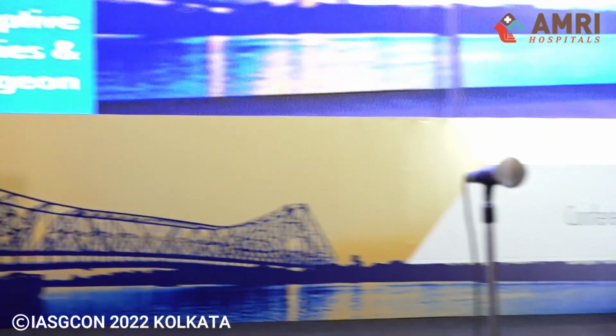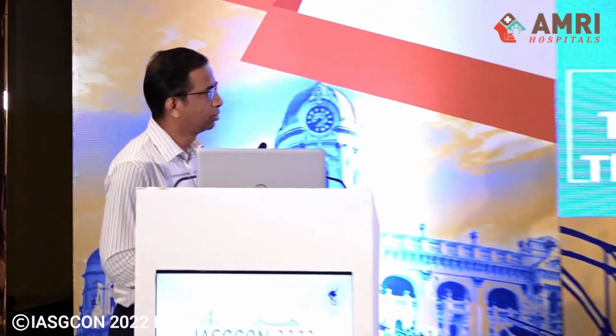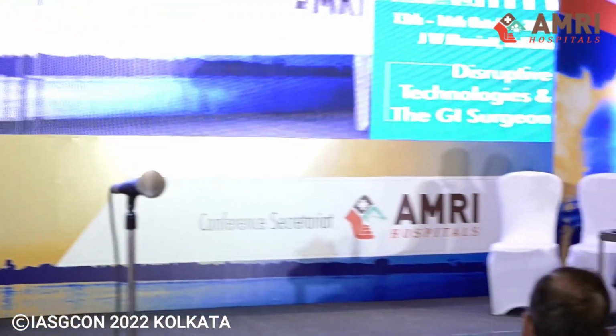Thank you, Dr. Ejaz. While we wait for questions from the floor, would you consider endosonography also as part of radiological evaluation, especially since your nodes were not so good in many of those, apart from say PET? Endosonographies are usually not done by the radiologist most of the time. It is the gastroenterologist who does it. For us, it is more of the cross-sectional imaging that we try to put across in terms of GBC. So from the pre-surgical viewpoint, for those para-aortic nodes and all those, what would you consider as the best modality? CT scan, sir.